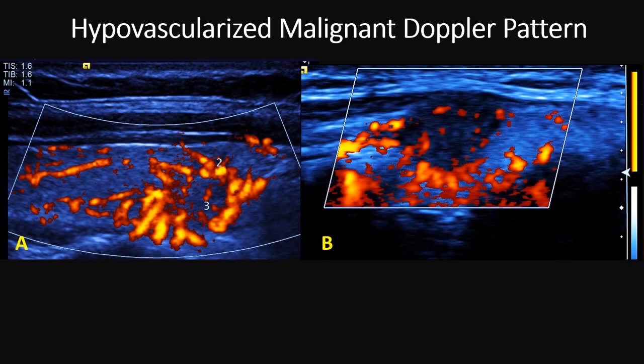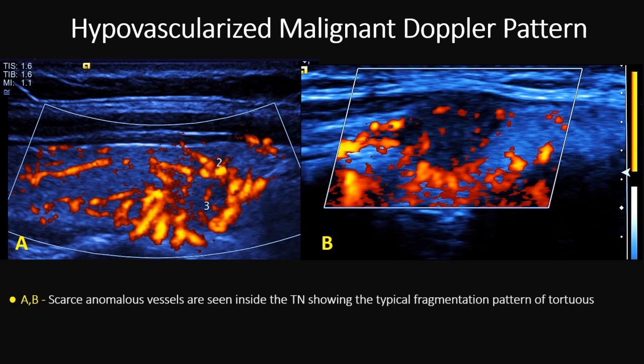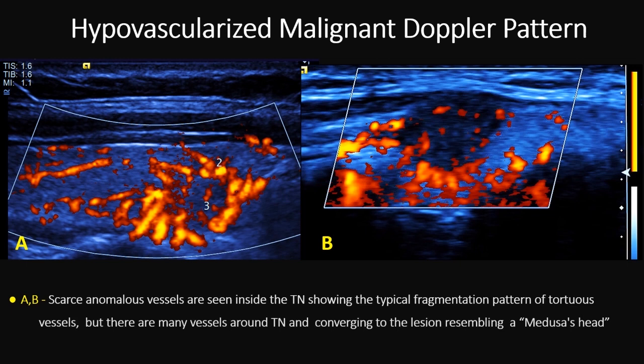Here we have two different hypovascularized malignant Doppler patterns. Both have a small amount of vessels inside, and in both we see this typical fragmentation pattern of tortuous vessels. However, there are many vessels around these thyroid nodules that resemble a medusa's head — very typical of malignancy.